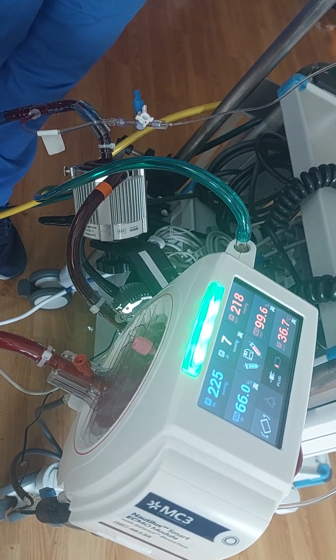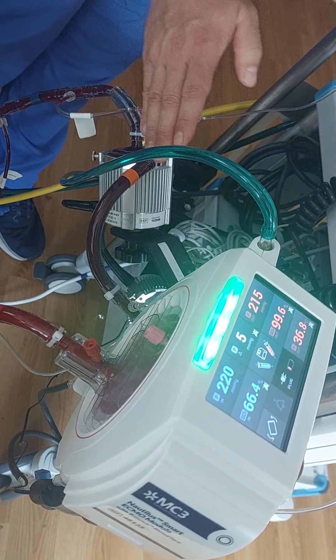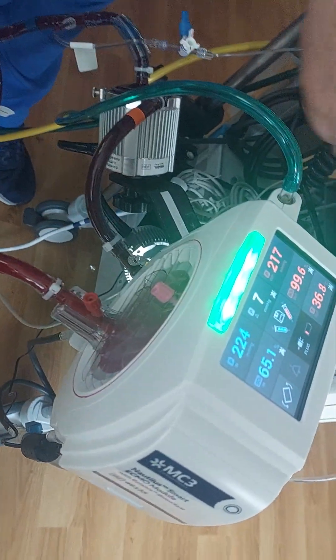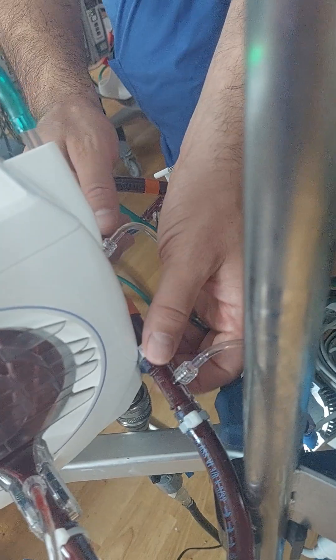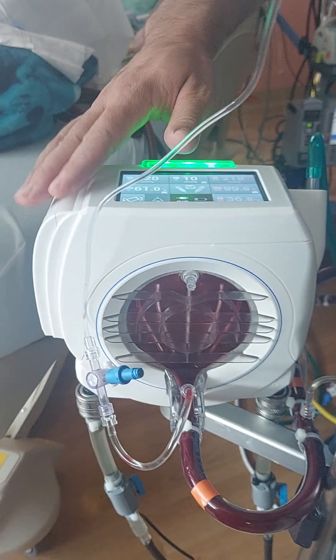Once it reaches the pump head, the blood gets displaced forward into the post-pump pre-membrane line. So you have negative pressure on the venous limb and positive pressure post-pump. The patient's venous return is then displaced into this post-pump pre-membrane line before it finally reaches the inlet of our oxygenator. This oxygenator here is called the Nautilus — it's a circular flow design membrane.